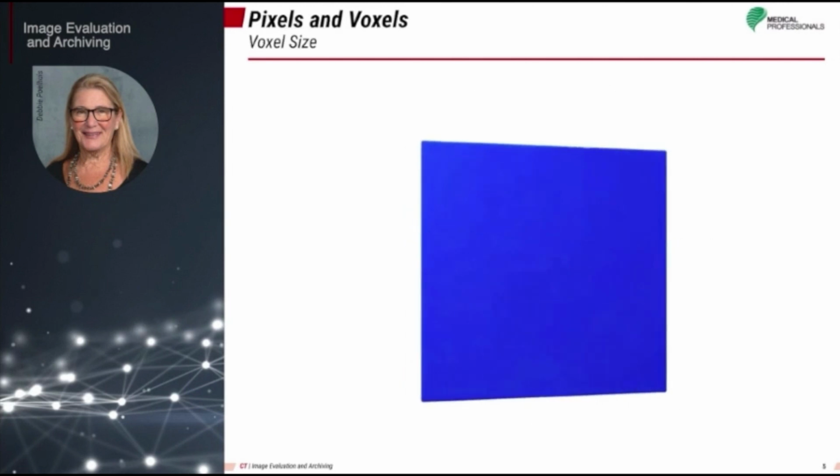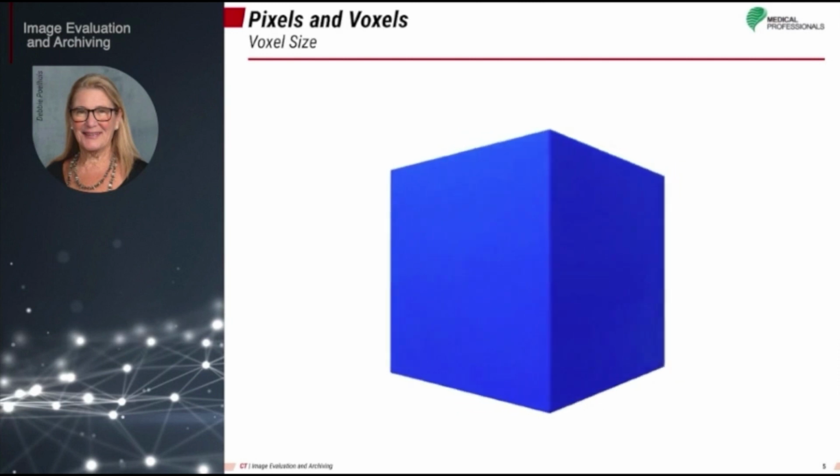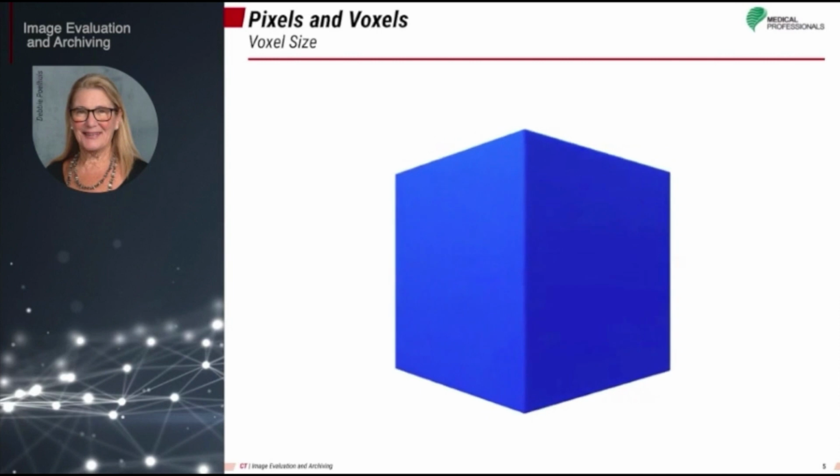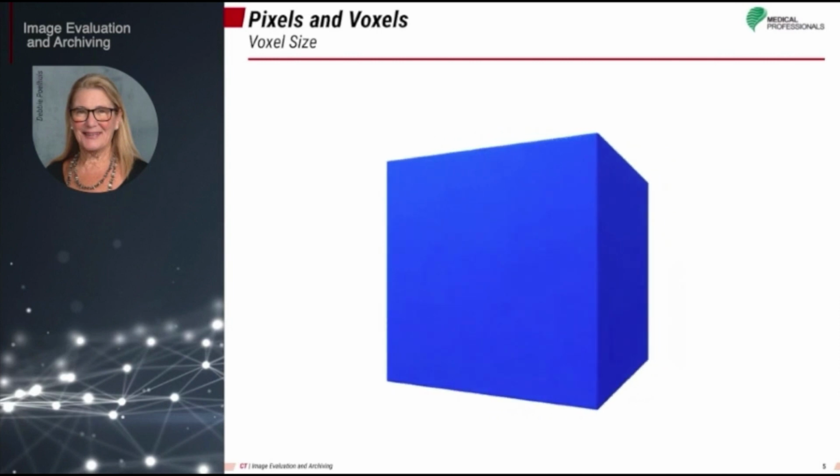Voxels, on the other hand, are fairly complicated to understand, but can be defined in the easiest of language as a volumetric pixel. We can define a voxel as a value on a grid or matrix in a three-dimensional space, like a pixel with volume.